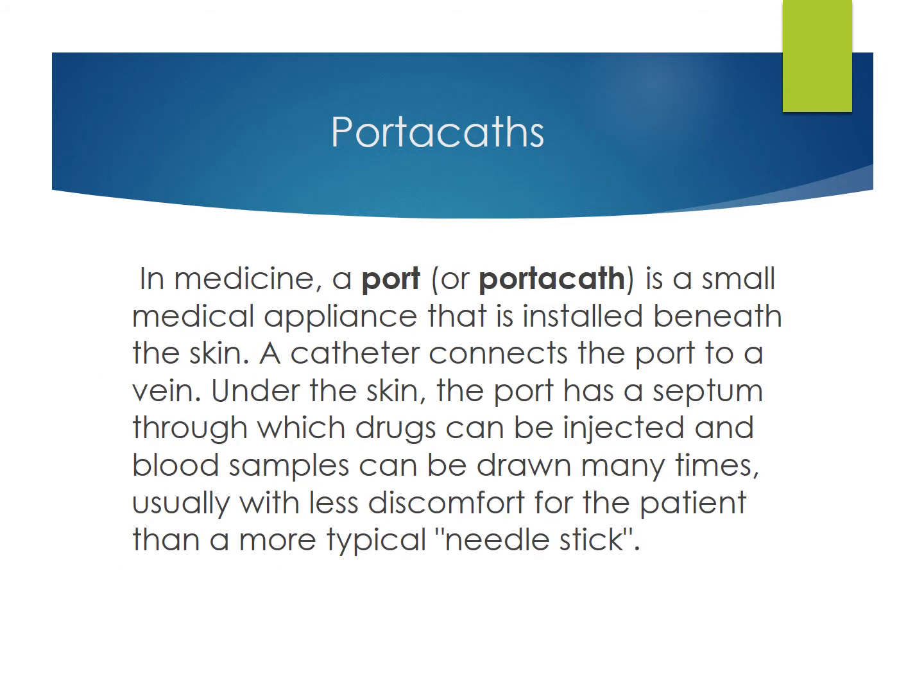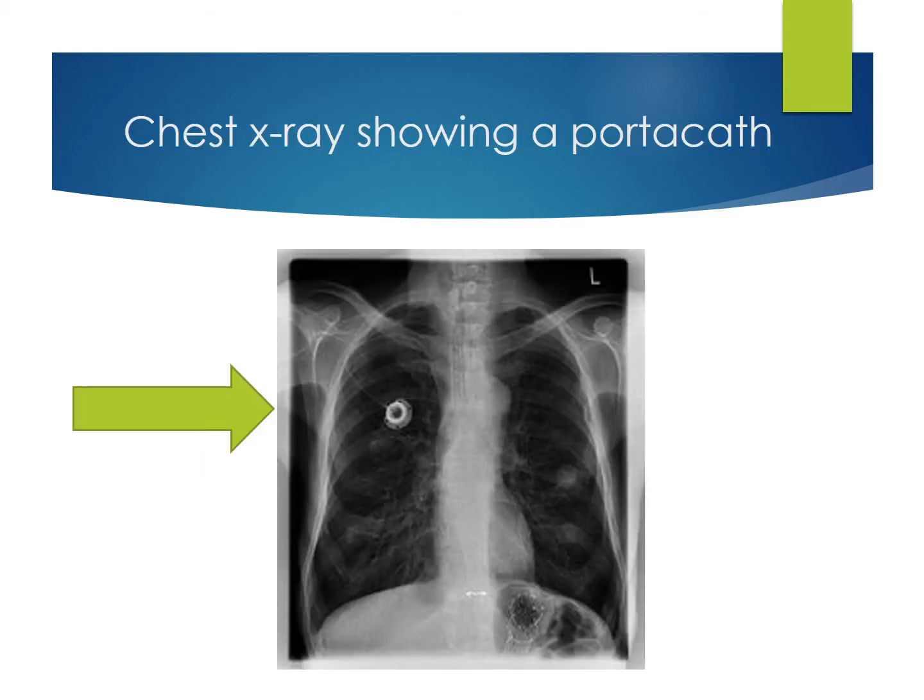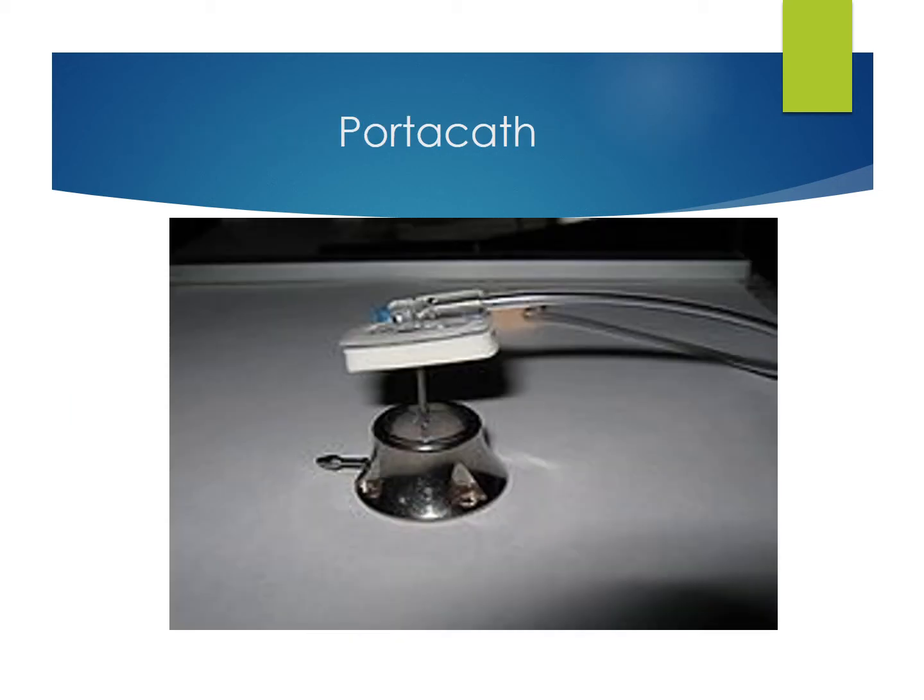Portacaths. In medicine, a port or portacath is a small medical appliance that is installed beneath the skin. A catheter connects the port to a vein under the skin. The port has a septum through which drugs can be injected and blood samples can be drawn many times, usually with less discomfort for the patient than with a more typical needle stick. Chest x-ray showing a portacath. This is an example of a portacath.